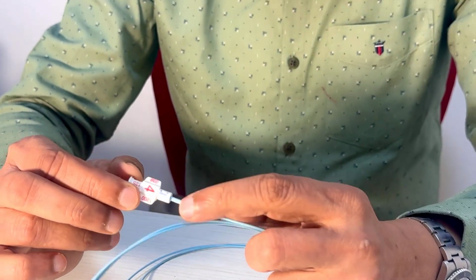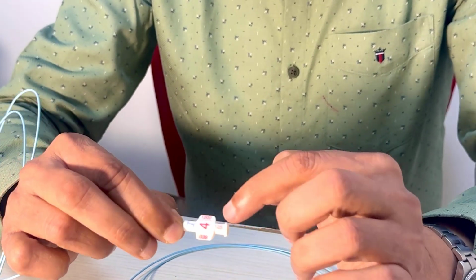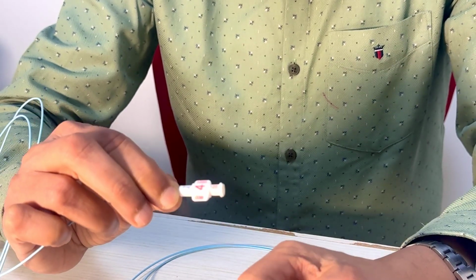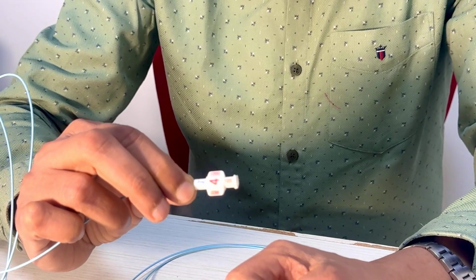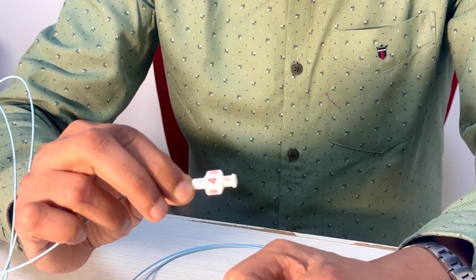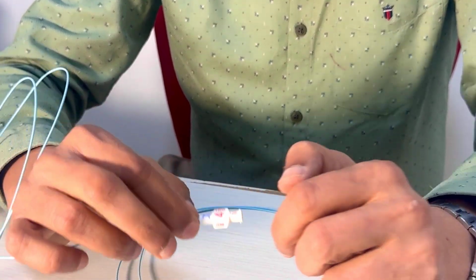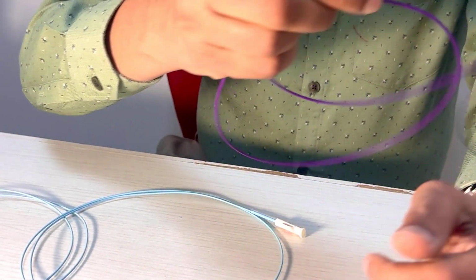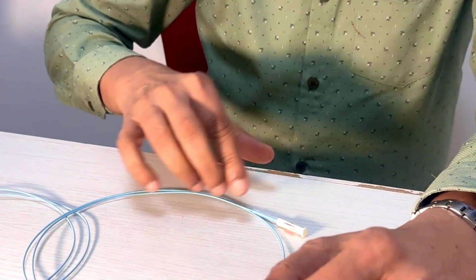The second thing you have to see is, sorry, this was upside down. You see the 125 written. Now there is a 038 written. So what does 038 mean? It takes a 038 guide wire. It's important because this tells you the guide wire compatibility of any catheter. So this is 038. This is also 038. And we have another catheter here. This is also 038.